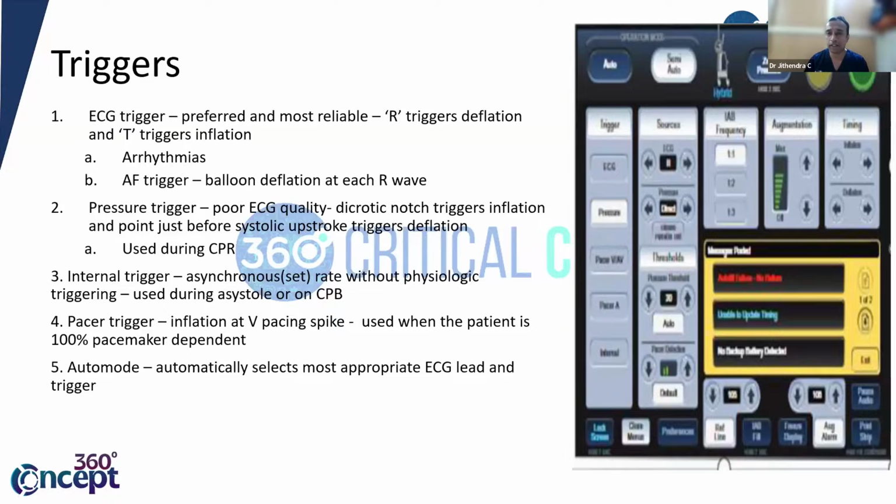If there is any abnormality in the timing of your inflation and deflation, you have an option on the interface of the console, so you can change the timing. Here you can see inflation and deflation. You can increase or decrease inflation, and you can increase or decrease deflation. So these are common settings that are there. You should know these terminologies.